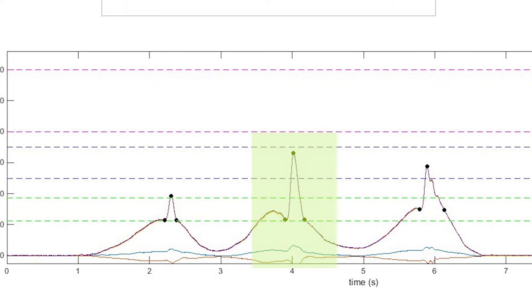This second thrust — if you see that dip before the thrust — that's you leaning into your patient but backing off before you actually put the thrust in. Then this third one: this person found really good tension, found that sweet spot, and thrust right through it and then backed off their patient.